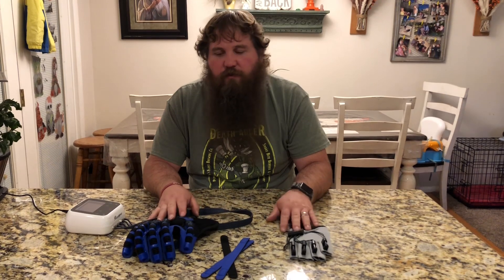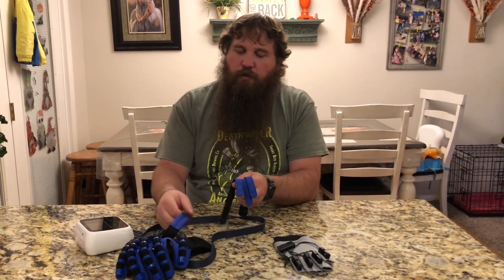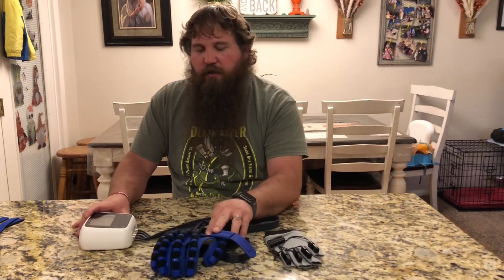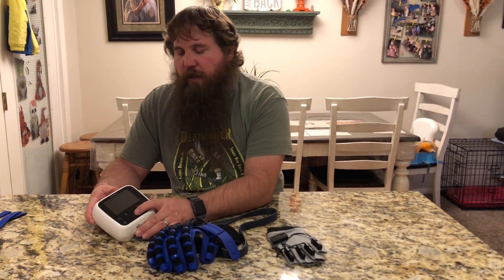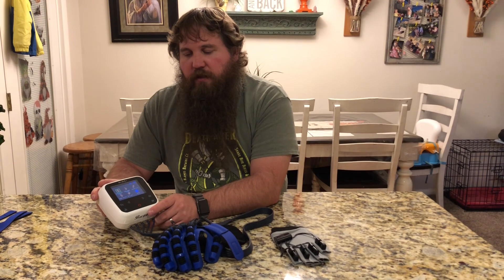I'm gonna show you the main uses for this and how to put the glove on and how to work the control unit. It also came with some extra straps if you need more to make sure the glove stays on. It fits my hand pretty good, so I'm just gonna set those to the side. I've got everything charged up and ready to go, so I'll go ahead and power on the control unit by pushing and holding the power button until the screen comes on.